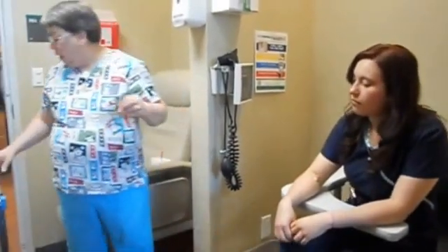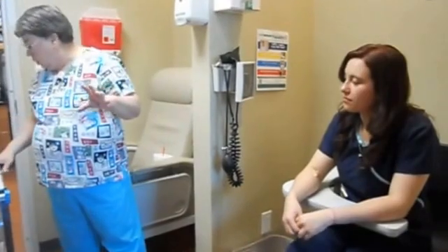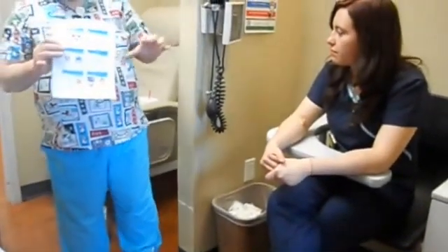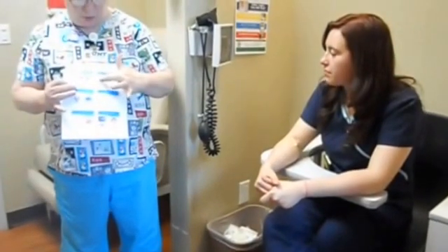The baby's heel must be warm before you do a heel stick. If you look on this slide, who knows where the Achilles tendon is? Show me. That's right, it's on the very base of the back of your foot. If you stick a baby in the very back of the foot, you can damage the Achilles tendon, and the babies develop drop foot where they can't support their foot. So always draw on the side like it shows on the arrows.